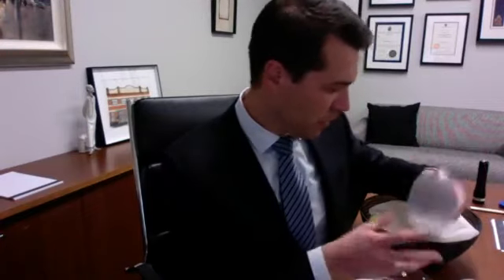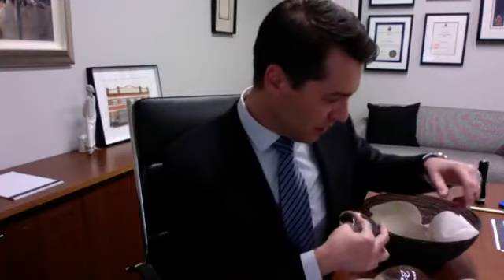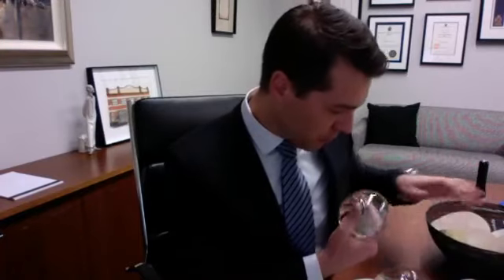The other implants, there is a different Motiva, which is similar to the Memory Gel Extra in terms of the fill. So it's called a Progressive Gel Plus, and it's just a firmer, fuller volume of implant, but still with the nano textured surface. So yes, at this point in time with my fruit bowl, what we're using: smooth traditional, smooth Memory Gel Extra from Mentor, nano textured Motiva Ergonomics, and the Progressive Gel Plus, the new TrueFix anatomical shape when needed, and that's pretty much it. Okay.